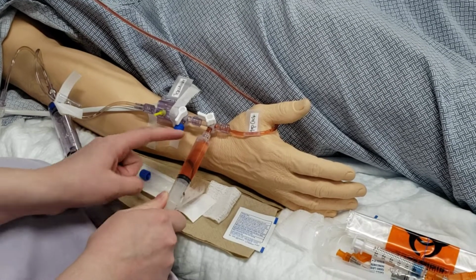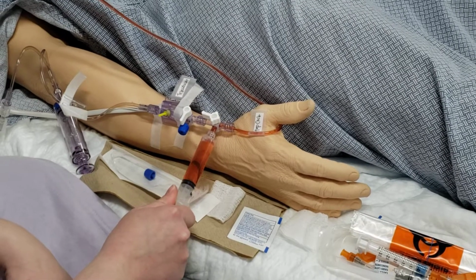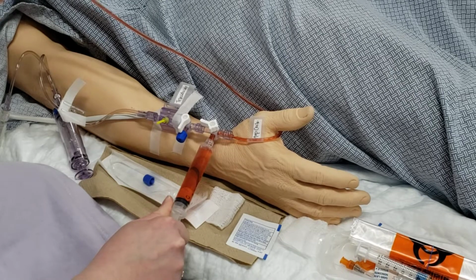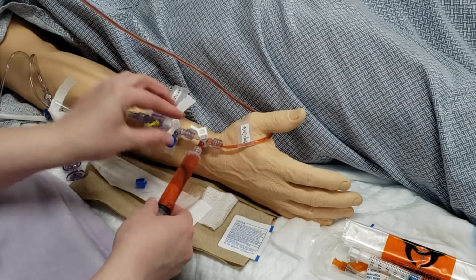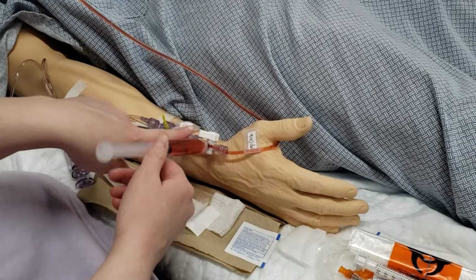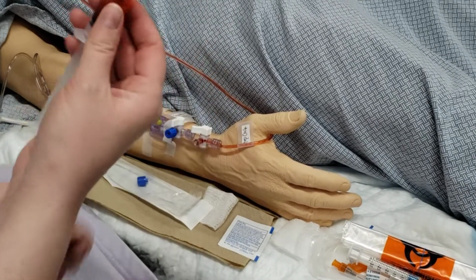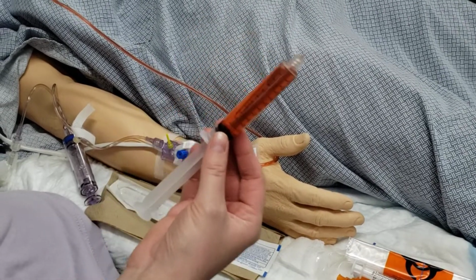See, we're starting to get blood, and we want to make sure we get the excess fluid that was in the line, excess blood, so that we can draw whole blood. After we draw and we get whole blood, we turn our stopcock off to everything, which is a little 45-degree angle. We twist this off and we dispose of this. I prefer to just throw it in a sharps container, which is totally appropriate, or a biohazard bin.